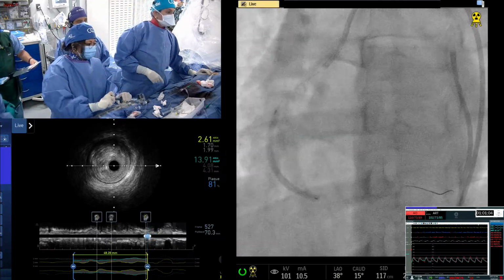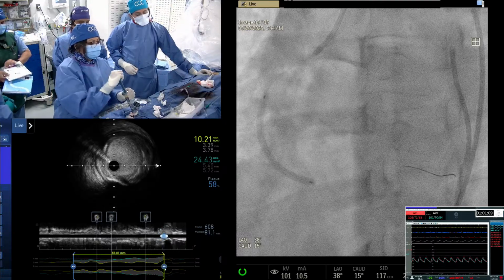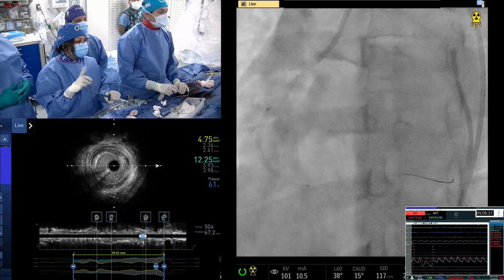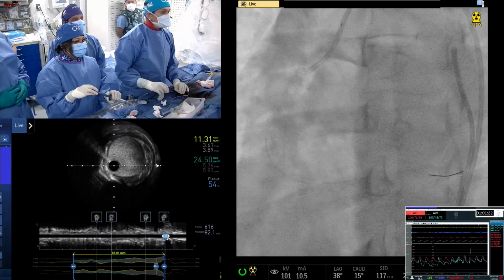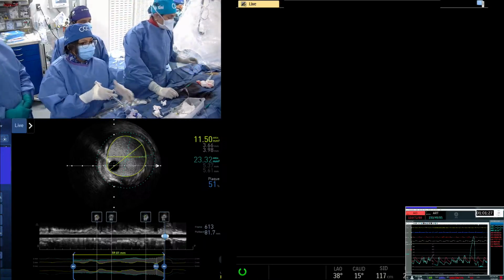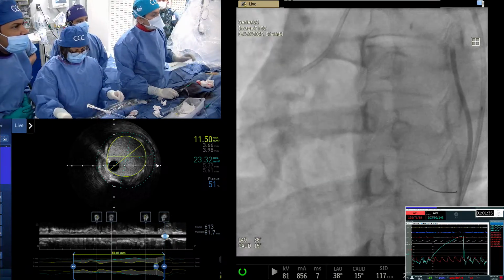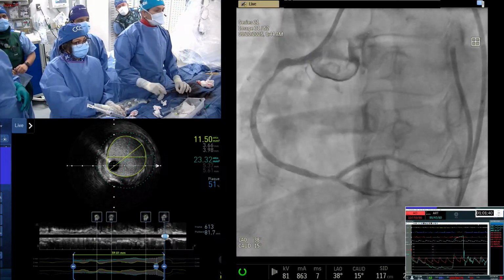You see that? Go. 14 or 16. Stent should be deployed at 14. Okay, what do you want, a 3.5 by 28? No, I think not 18. Longer, no? Okay, hold on. 23. No, hold on, one second. Let's bring this back. Yeah, good. Okay, now take a picture. Ready? 3.5, yeah, okay. That's why I said 3.5 by 23 will be okay. Have the IVUS ready again.